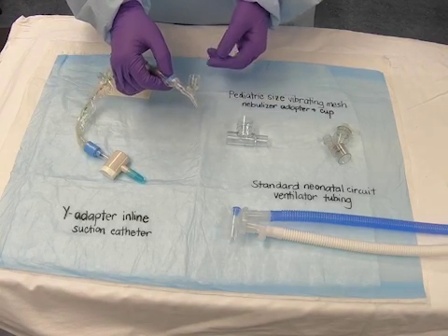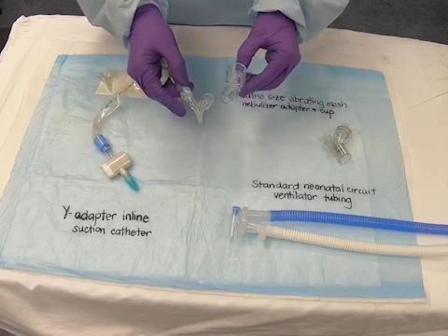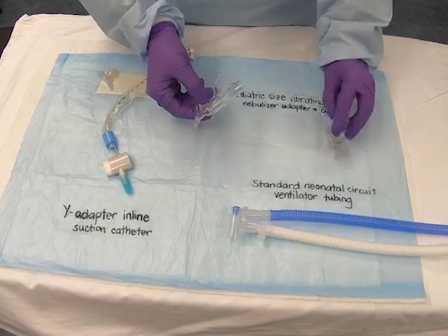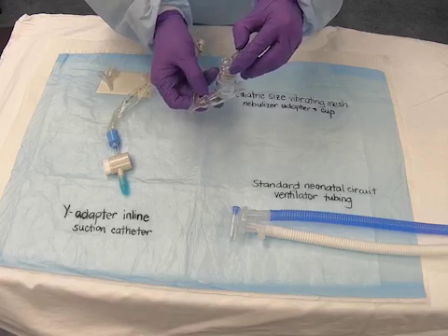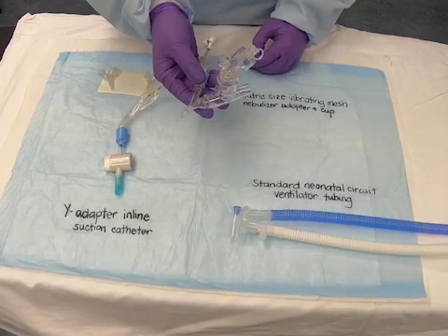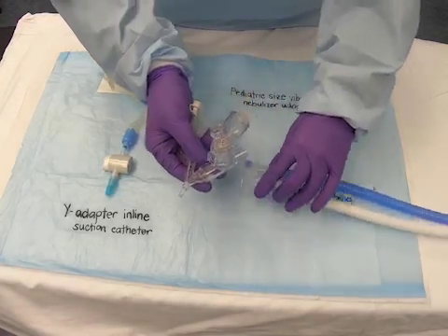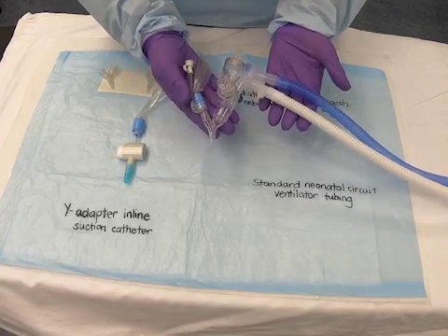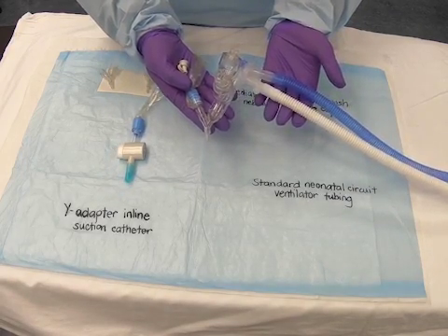Connect the nebulizer adapter to the Y-adapter and place the vibrating mesh puck to the nebulizer adapter. Connect the nebulizer adapter to the ventilator tubing. This setup will be kept ready by the respiratory therapist before the baby is intubated.